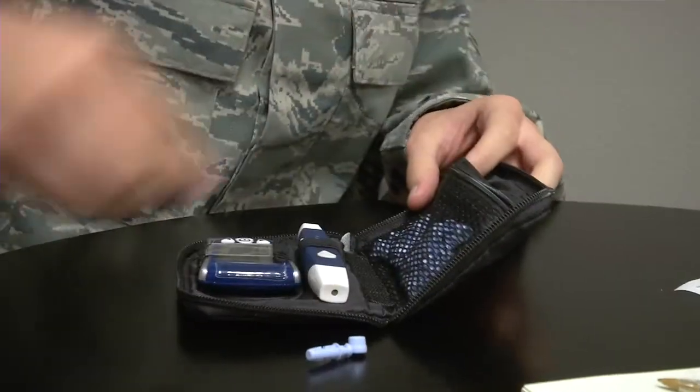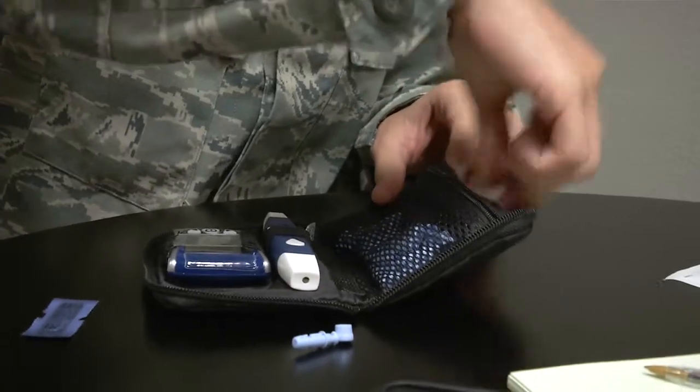Checking your blood glucose level is a simple process using a lancing device, test strip, and a blood glucose meter. Check with your health care team to determine how often your blood glucose level should be tested. You may be asked to check your readings before or after meals, activities, or medications.